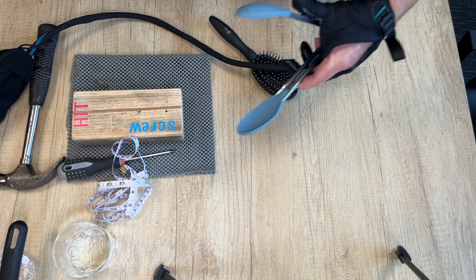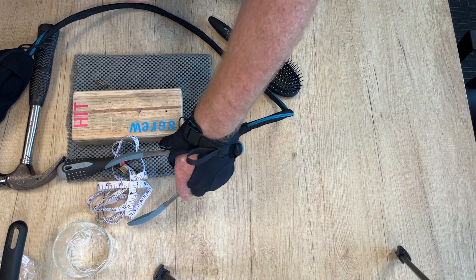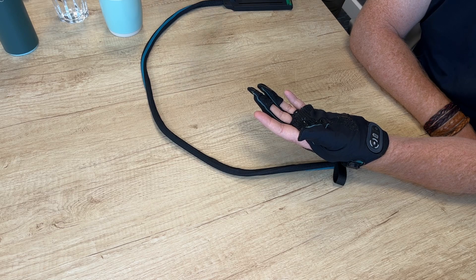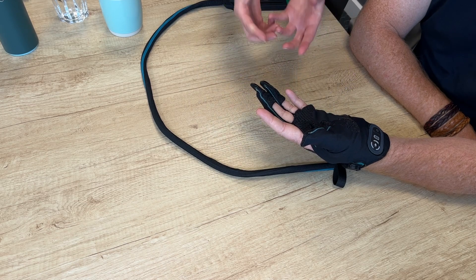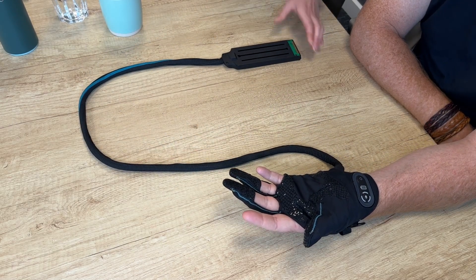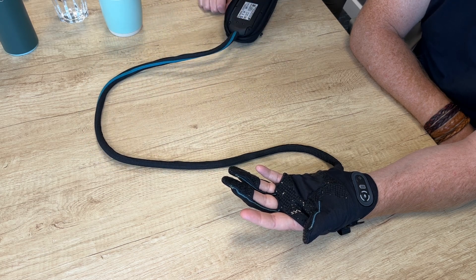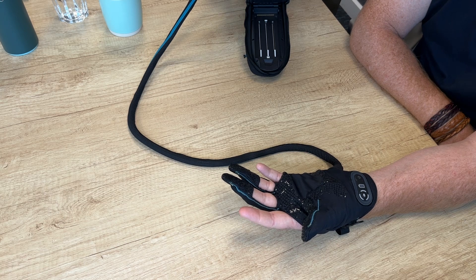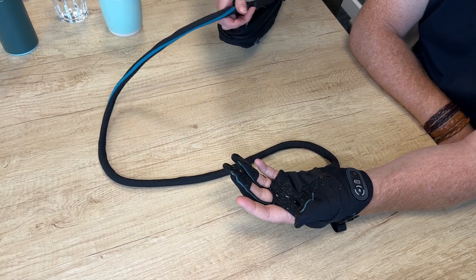The glove has sensors in each of the fingertips and at the MCP joint. These finger sensors measure how much pressure you're placing on an object — your intention to lift something. Inside the blue thread running through the glove are tendons attached to motors that run through into the power pack. The pack attaches with a little magnet. The motors drive the tendons to allow the hand to grasp and then release — it assists with closing the hand and maintaining endurance, not opening it.